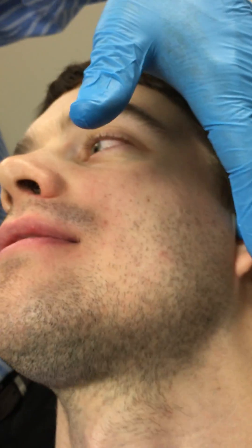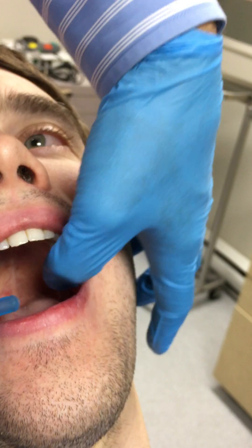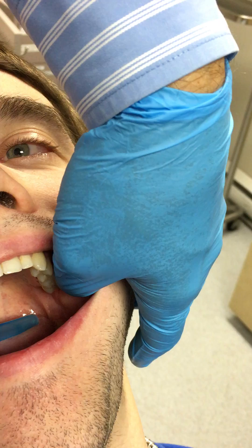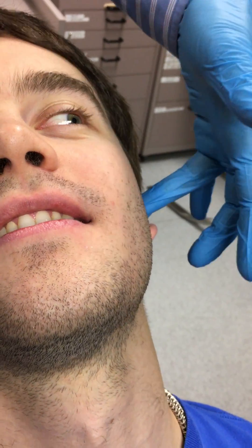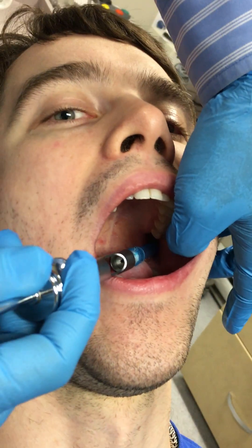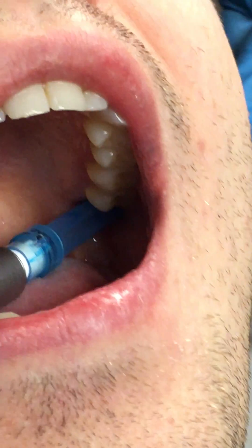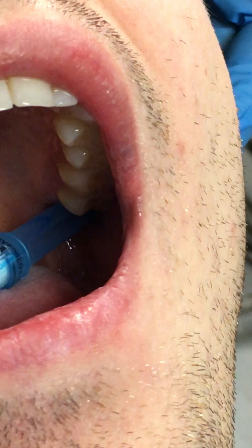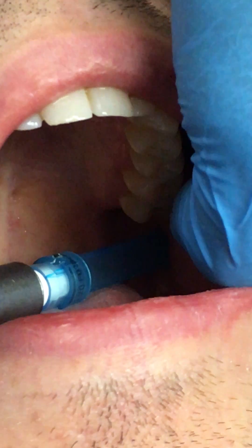Now the Gow-Gates. When I'm teaching the Gow-Gates, I put my finger inside here because the tragus is what I'm looking for. You're at the level of the occlusal plane, all the way up here. For your Gow-Gates injection, I'm going to be aiming for that finger and you have the patient open wide. You're coming all the way across from the contralateral bicuspid area, going upward. You go in until you hit bone, back off, make sure that you aspirate, and away you go.